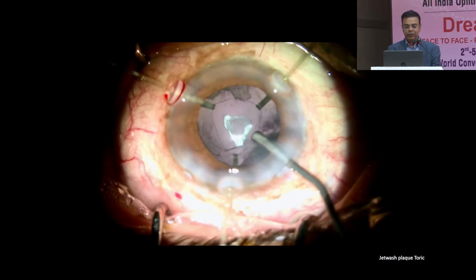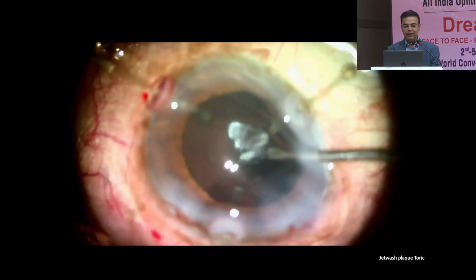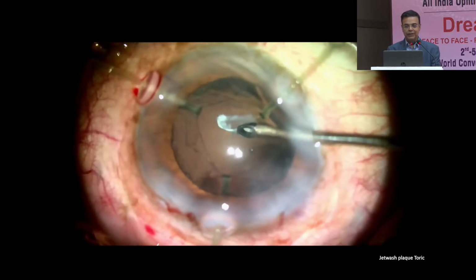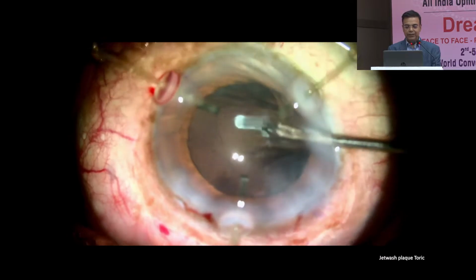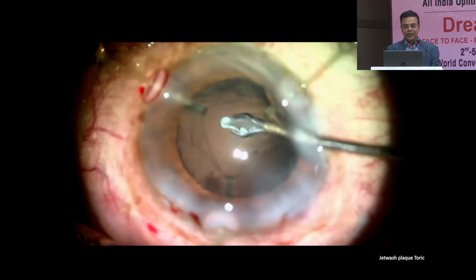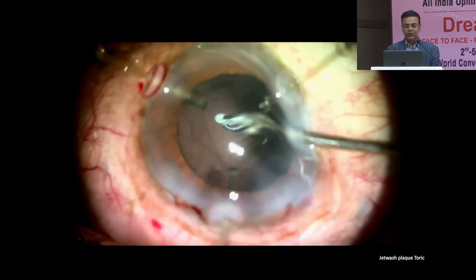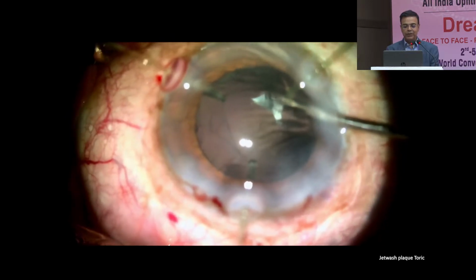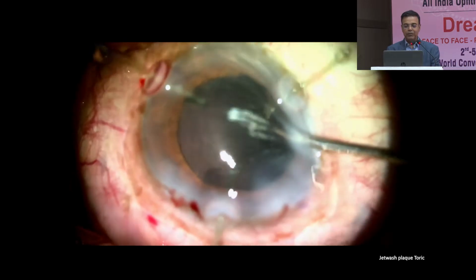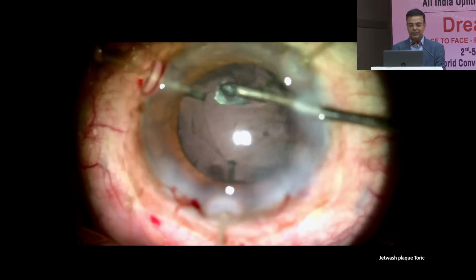Now we have to deal with this central plaque, which will require it to be peeled, because the only other option would have been to do it with a cutter or maybe make a small rhexis in the center. So we gently peel it. As you understand, the capsule is very, very friable, so you have to be very careful, change hands, change directions, pull it in one direction, then the other, so that you don't rupture the posterior capsule, and very gently nudge it and pull it, so that you can somehow get it off. Most often you can, and sometimes you end up burning your fingers as well.